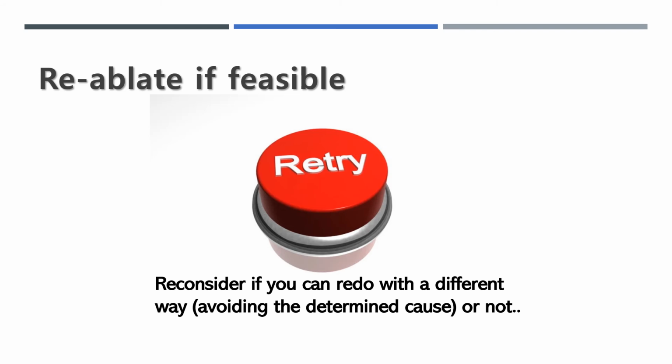Reevaluate the tumor and ablation zone with fusion and/or contrast-enhanced ultrasound and check the possibility of accurately achieving the complete ablation with reablation. More careful ablation and careful finishing are still essential to guarantee the final technical success.